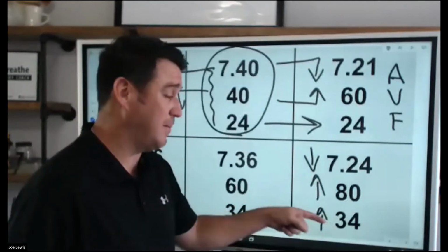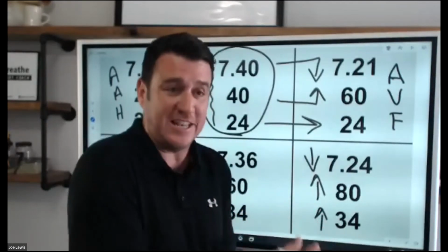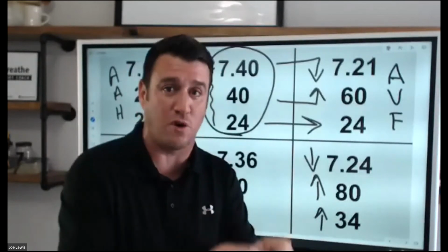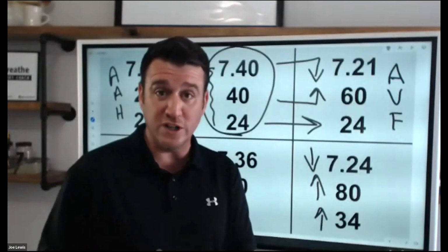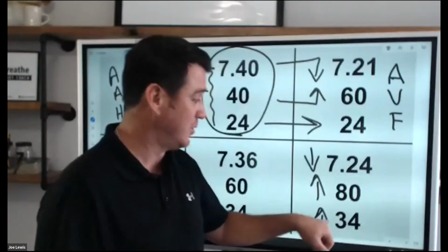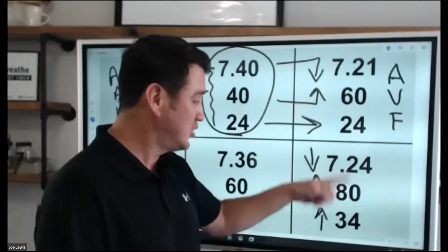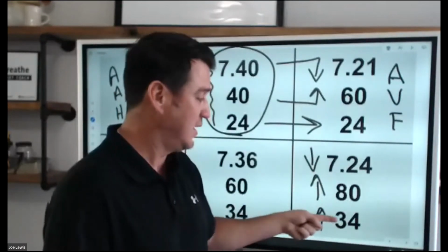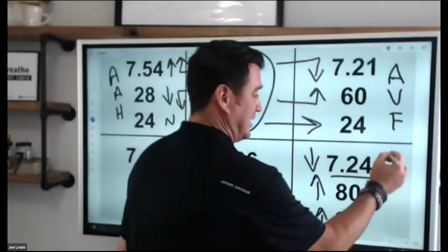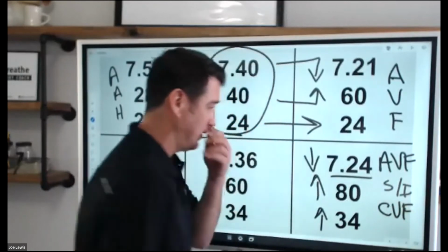This elevated bicarb tells us, and of course, you have to put some patient assessment skills into this, because you have to be able to get to the point that, oh, there is an underlying chronic pulmonary disorder present. Once you have those clues, those signs and symptoms, that patient history, pack years, extremely valuable in this. If this is a patient with 80 pack years, this is a superimposed blood gas. This is a state of chronic ventilatory failure. But because we are acidotic, we know this is acute ventilatory failure superimposed on chronic ventilatory failure.